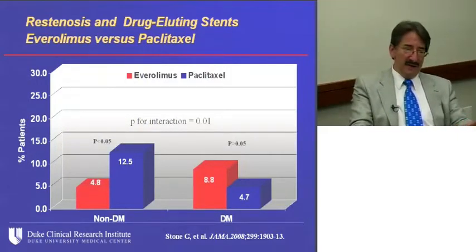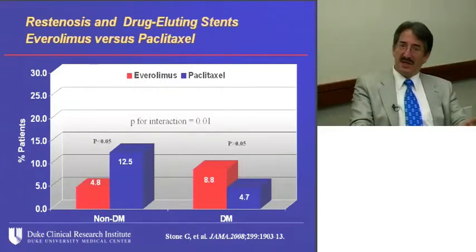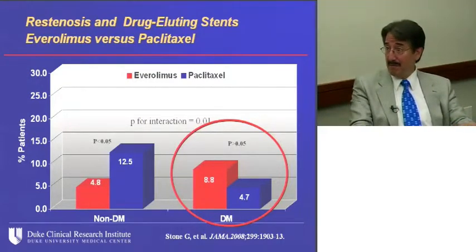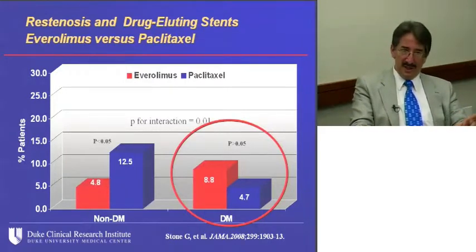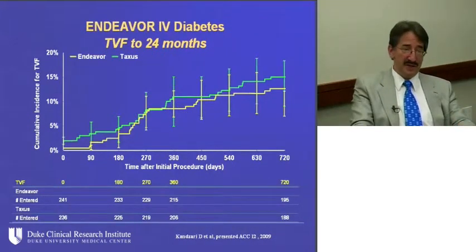Well, what do we know? At least for everolimus, very interesting in that head-to-head against paclitaxel, the SPIRIT series of trials of the Xience versus the Taxus stent have been very consistent over multiple populations that Xience V is a better outcome. And yet when you look at the non-diabetic population, that's where most of the benefit is. When you look at the diabetic population, it's not so clear. The individual trials, I think you can pretty solidly say that individually the diabetic population treated with paclitaxel and everolimus comes out about the same. But when compiled over multiple trials, it almost still starts to tilt the other direction. And you wonder, is everolimus sufficient in diabetics for the degree of restenosis that we see?